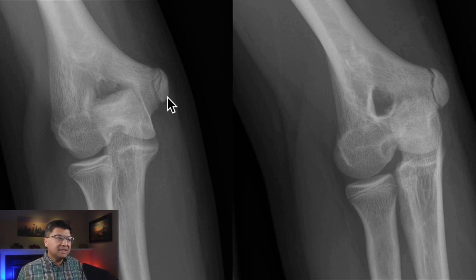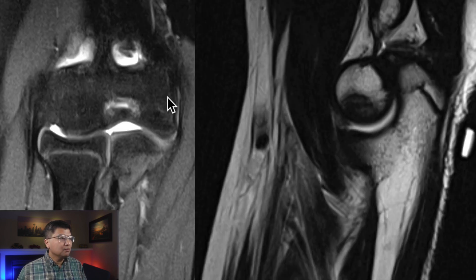Let me now show you the MRI. Here is a fat-suppressed fluid-sensitive sequence on your left and a T1-weighted sequence on your right. Let me just outline the anatomy just a little bit for you. We always talk about the radial head and capitellum as being a joint and the ulna and trochlea as being a joint.